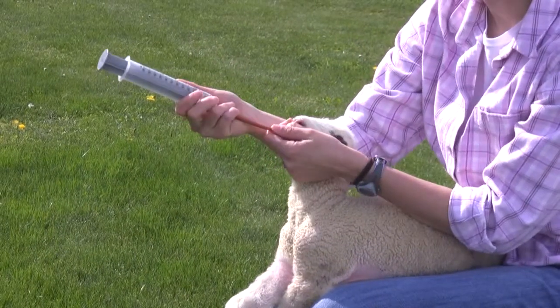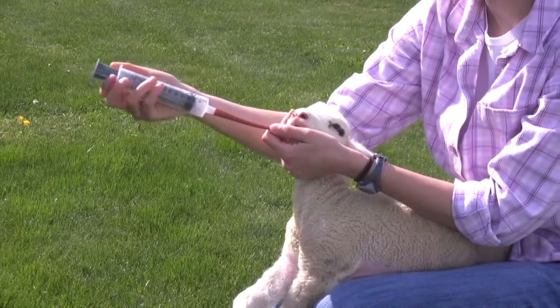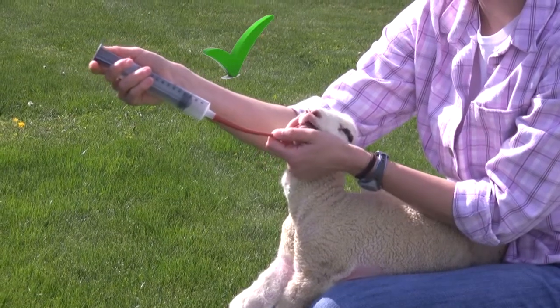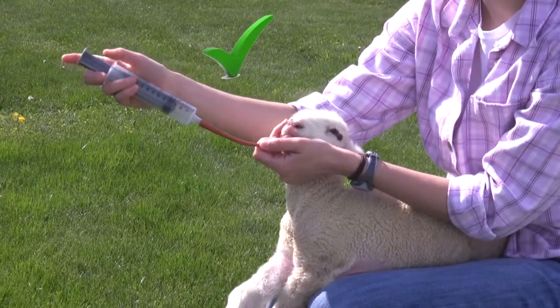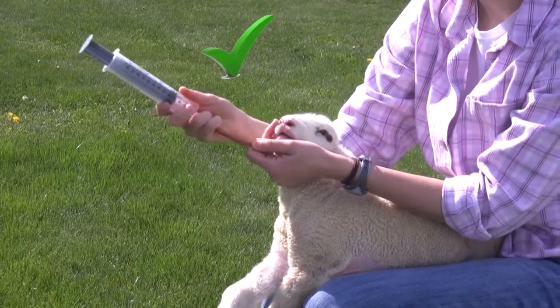The simplest way is to attach the syringe. Try pulling the plunger back. If it is very difficult to pull more than a few cc's, you are in the proper place. However, if you can easily pull the plunger back, it means you are pulling air from the trachea and lungs. If this happens, remove the tube and try again.